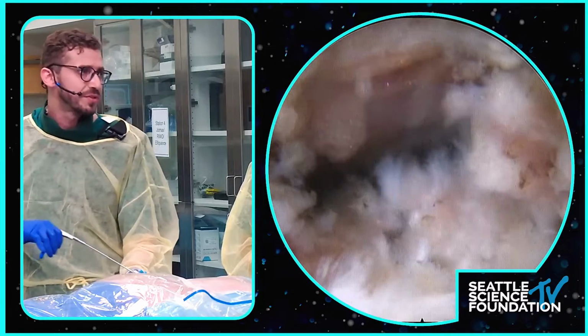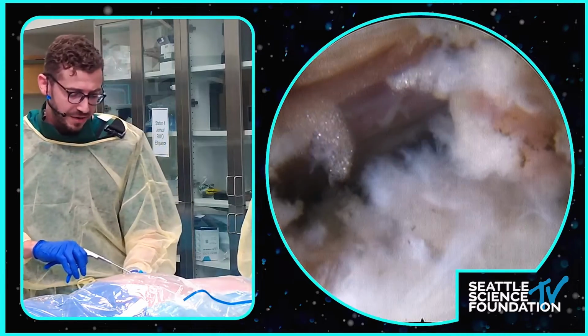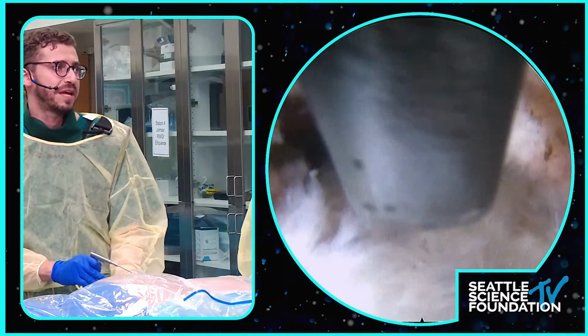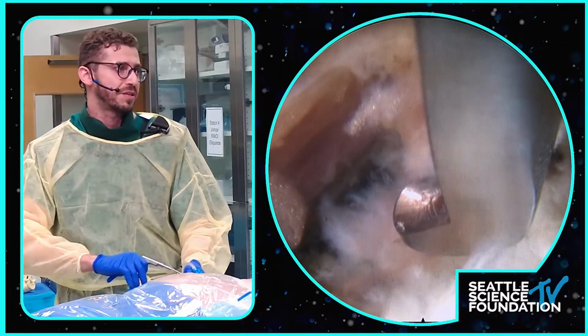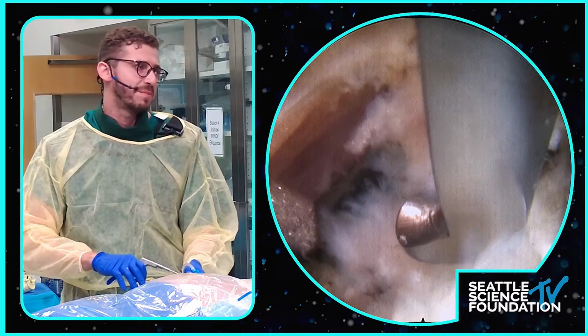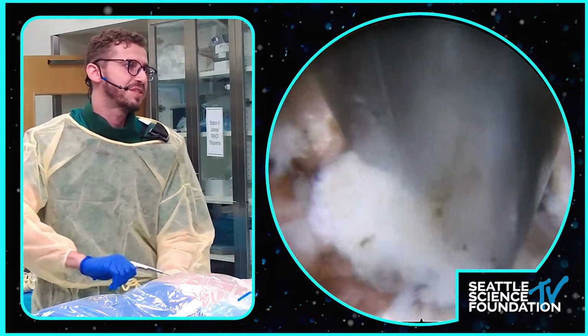Absolutely. So let's start with drilling the osteophyte, like Dr. Hofstadter was saying. If I go like this, I can't really see my instrument. I can't see anything, right? But if you have just a little bit of an angle between your endoscope and your working instrument, then you can see. That's the benefit of endoscopy: you can see every bite that you're taking. There are no blind bites, or there shouldn't be any. So this is the marginal osteophyte right here.